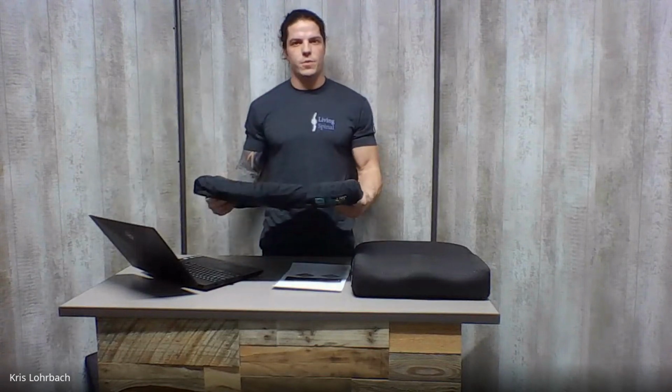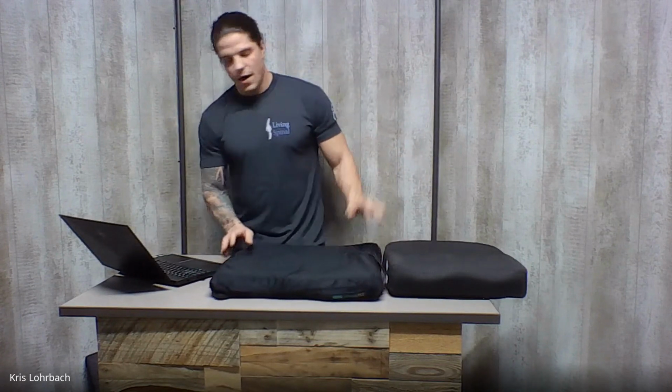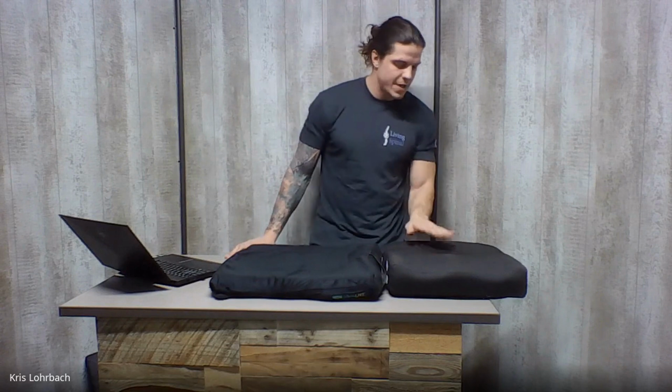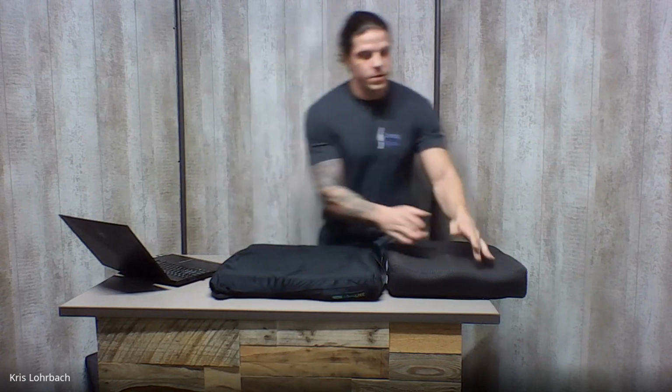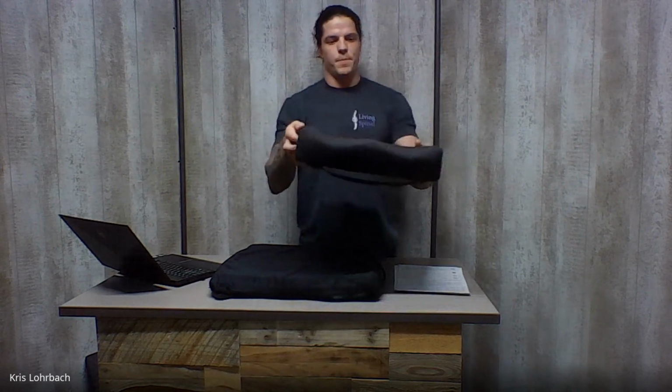Cushion contour. So we have a contoured cushion versus a non-contoured or a flat cushion. The difference is a contoured cushion is going to be more tailored to a person. So it has a formed shape. You can kind of see it here. You can see it there. Yeah, that's much easier. You guys can see that.